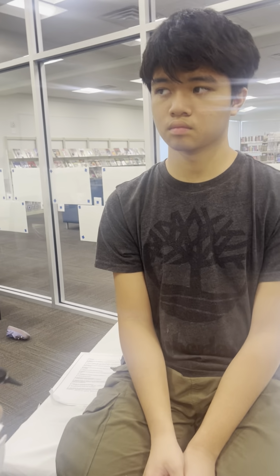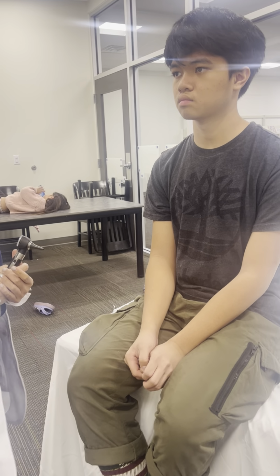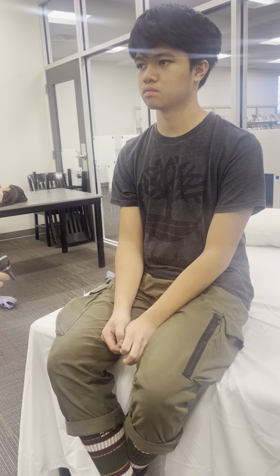Okay. And then next we're going to check your hearing acuity. Okay, so there's two types of tests where we can test hearing. One is the Weber test, and then the other one is the Rinne test. And with this one, I will use a tuning fork.